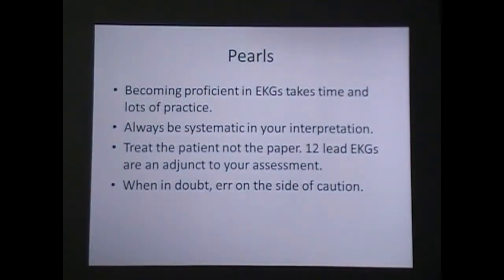So, pearls. It takes time and takes practice. If you spend 10 minutes a day looking at EKGs, it helps. It's a simple thing, even if the training guide sent out an EKG every week or two and made it a game where you get something for the right answer. Always try to be systematic. It's really easy, and I do the same thing, where I jump on something and focus on it, and I have to draw back and look at the overall picture to see if I missed anything.